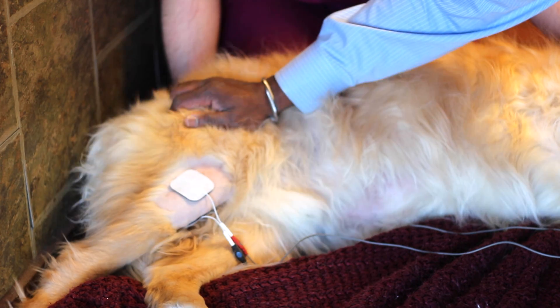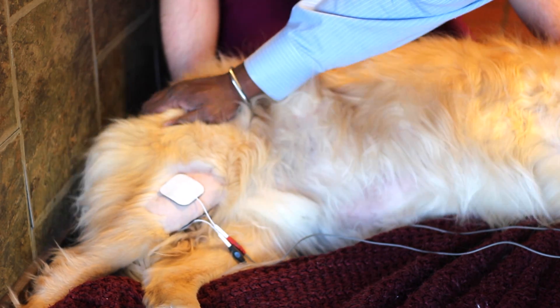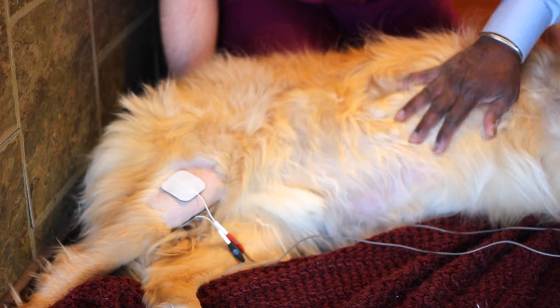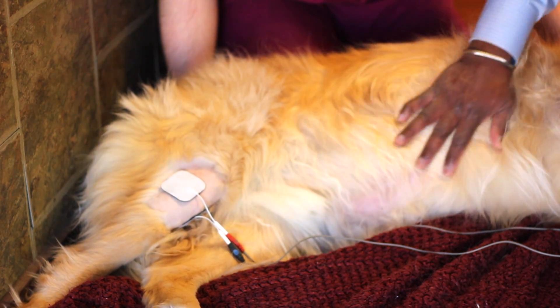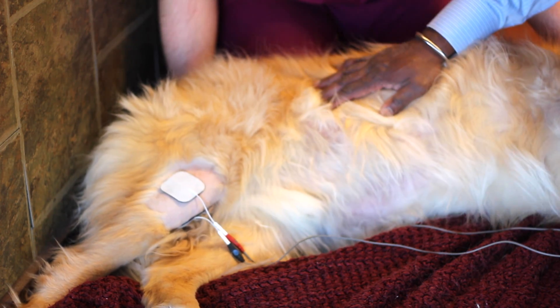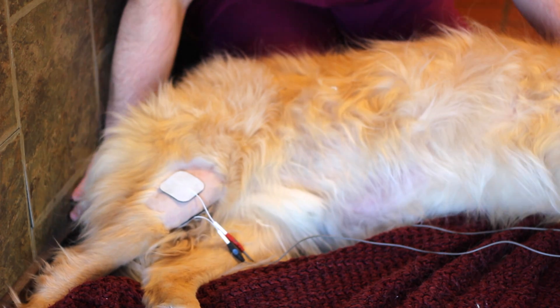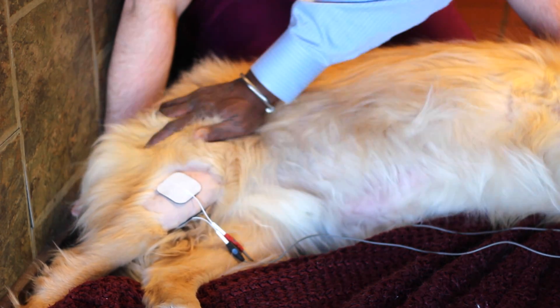Because he's painful today, we chose to use electrical stimulation. Electrical stimulation goes way back in time, where we use electrical probes to stimulate the nerves to relieve pain.